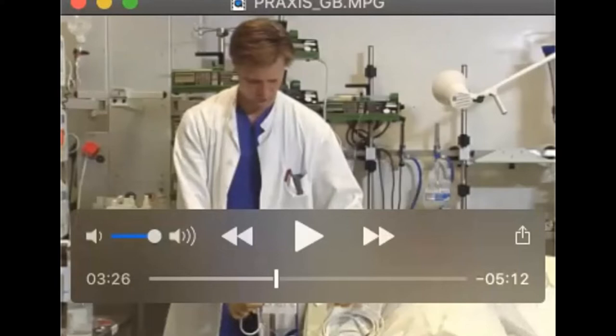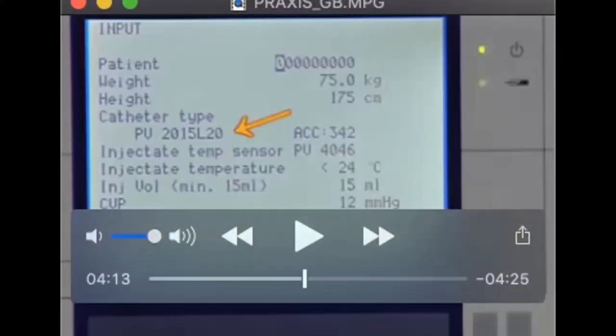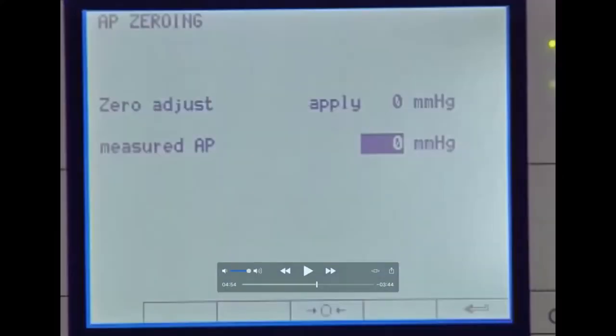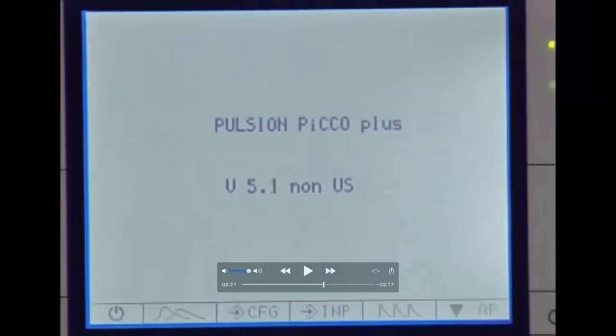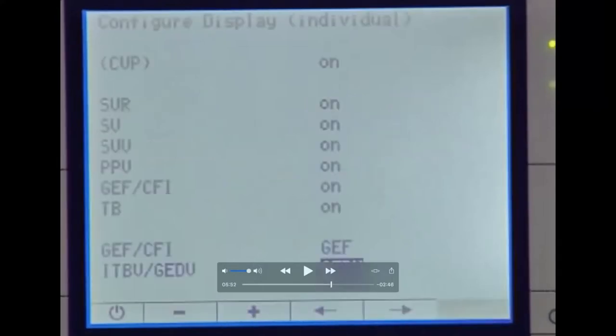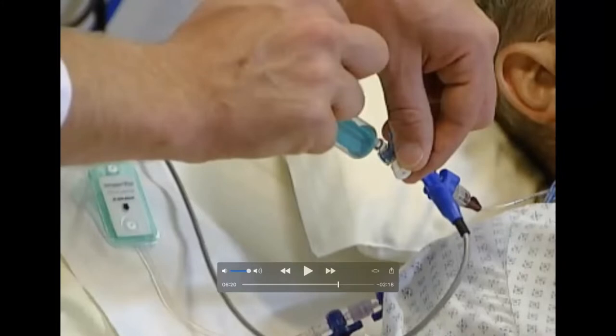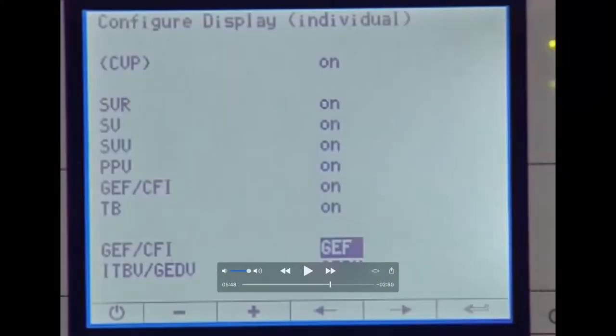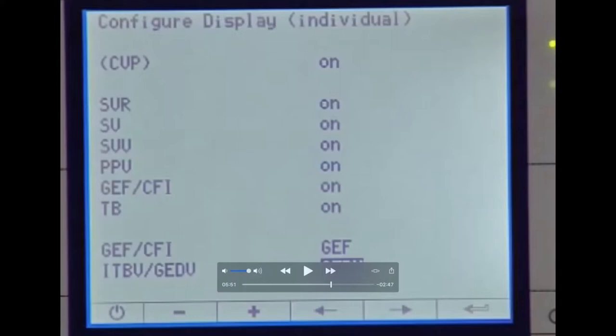Do you want to forward this? A little bit more. Because he's showing how to inject the cold saline. Okay, that's right. This is the one, right? So we are going to see how to get the cold saline injected into the catheter system, right? So we are just skipping the rest and we'll see how the cold saline is being injected, right?